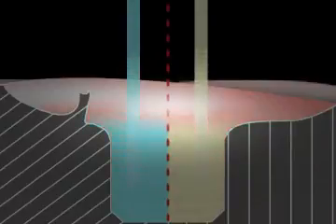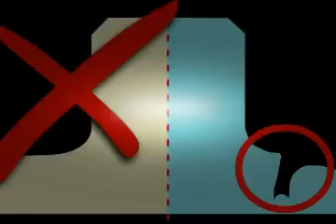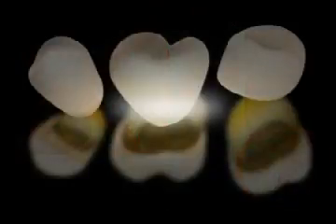On the right, the preparation limit is clearly visible. On the left, you can see what happens if ligatures are not used. The plaster mold doesn't correspond to the stump preparation, since the impression material hasn't moved into the limits of the prepared area due to the gums and/or blood and/or saliva being in the way, so the technician in this case will unknowingly prepare the crown incorrectly.